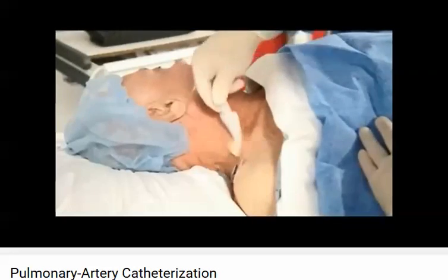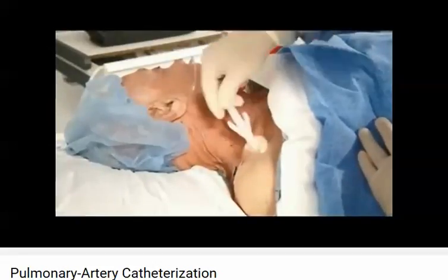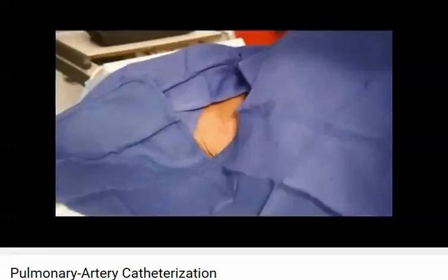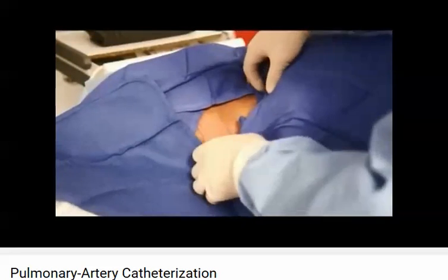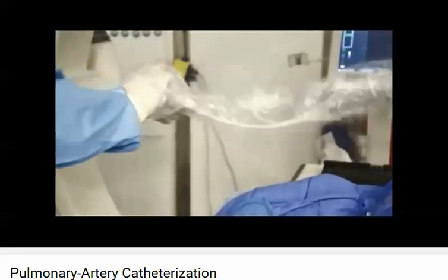After thoroughly washing your hands and donning the sterile garments and sterile gloves, prepare the skin over the vein with chlorhexidine. Place the sterile towels and drape over the patient. Cover the ultrasound probe with the sterile sleeve.